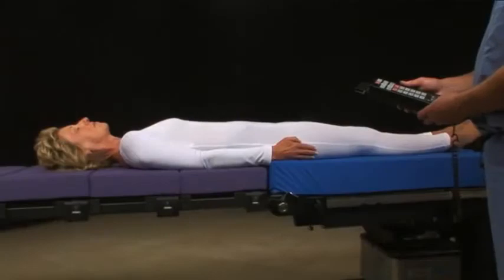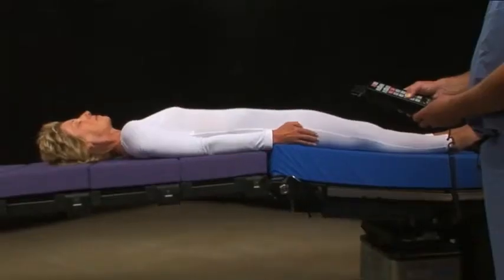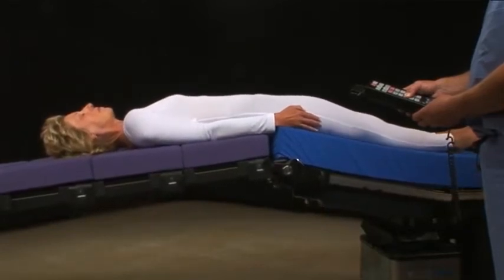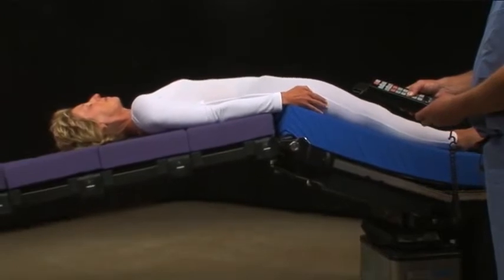Powering the OR table intraoperatively flexes the patient, which arches the back, and in turn opens the anterior disc space. This position may aid in anterior disc removal and implant insertion.